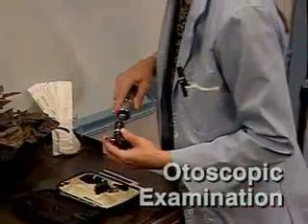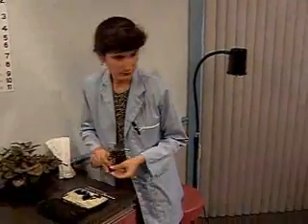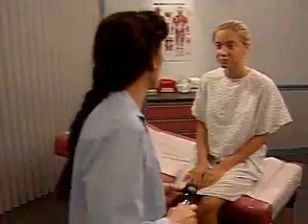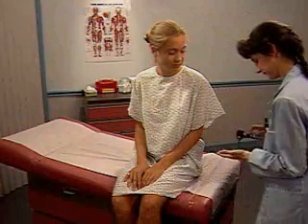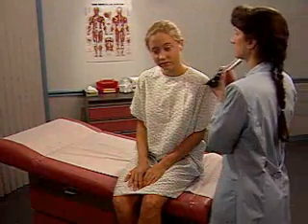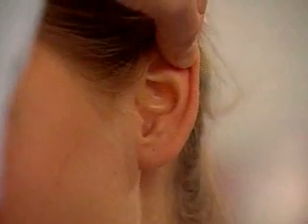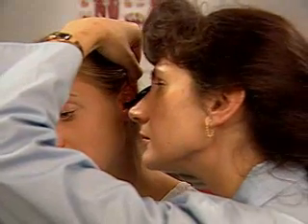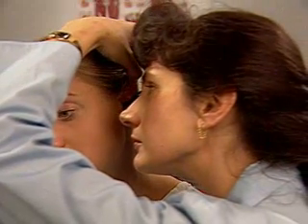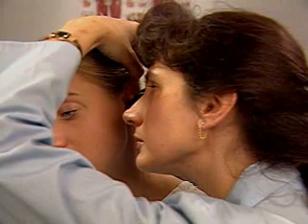Next, examine the ear canal and eardrum using an otoscope. To do this, select the largest speculum the patient's ear canal will accommodate. Position the patient's head so that you can see through the otoscope comfortably. Grasp the auricle firmly but gently, and in an adult, pull it up, back, and slightly out to straighten the ear canal. Then insert the speculum gently into the ear canal.